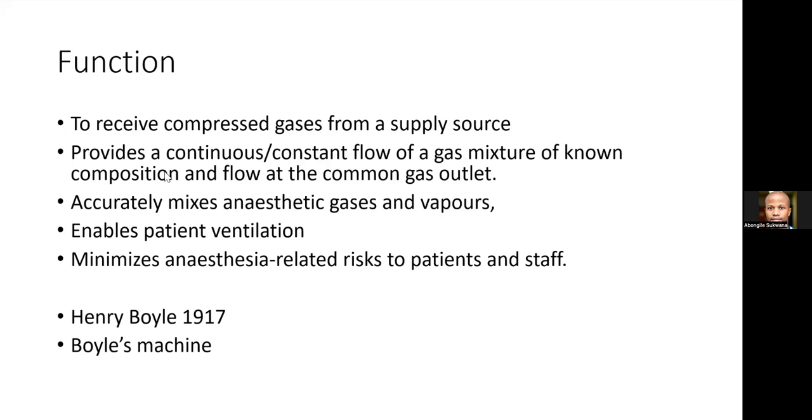When he made Boyle's machine, there were already existing machines, so he built from something. But mostly the machines that we use now are modifications of the Boyle's machine.